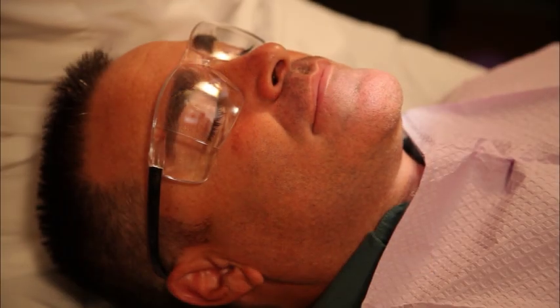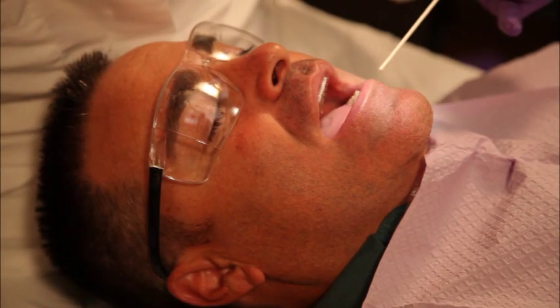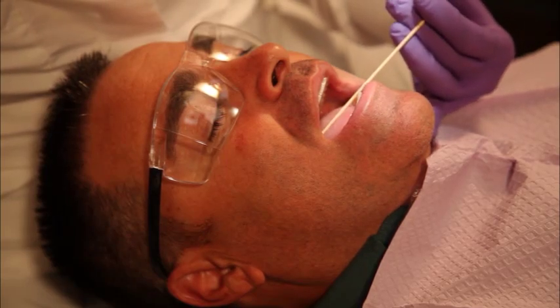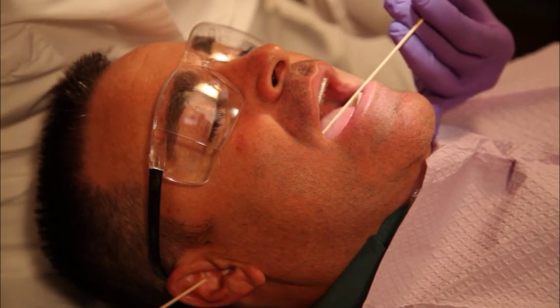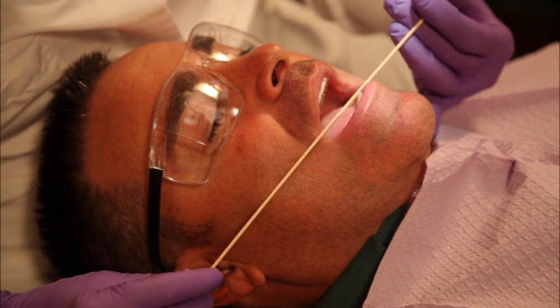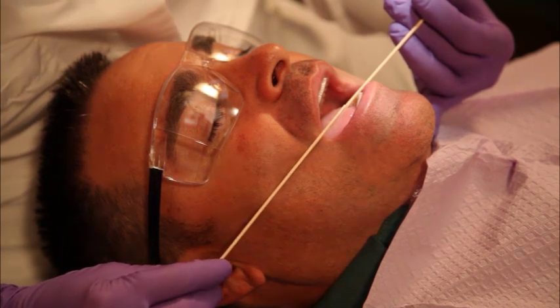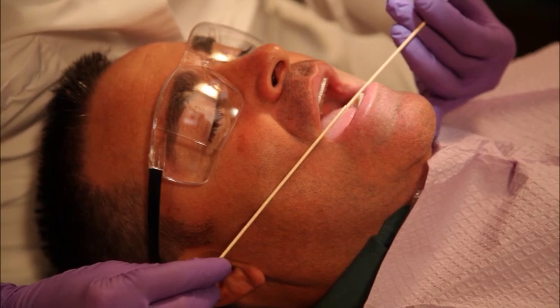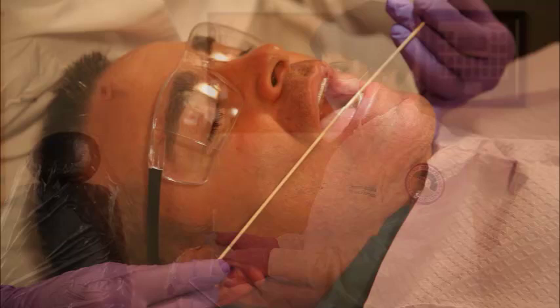The injection site is located intraorally on the oral mucosa on the medial surface of the mandibular ramus, just distal to the height of the mesiolingual cusp of the maxillary second molar, and following an imaginary line extraorally from the ipsilateral intertragic notch of the ear, the lower border of the tragus, to the ipsilateral corner of the mouth.